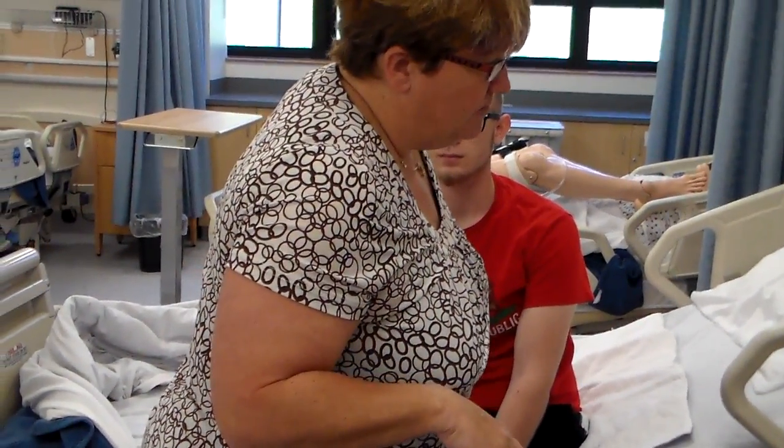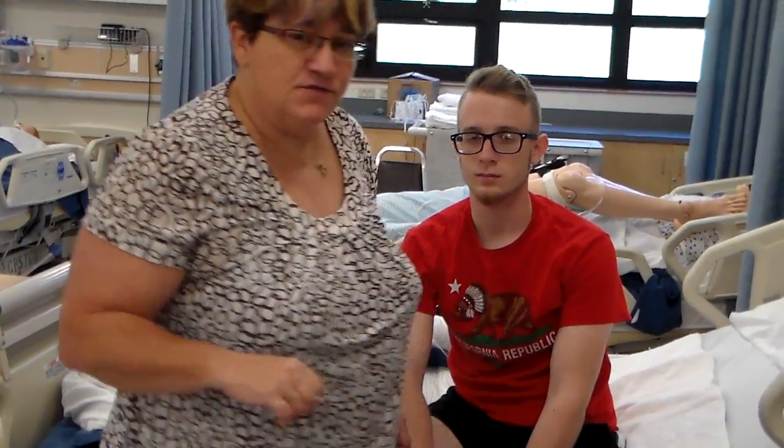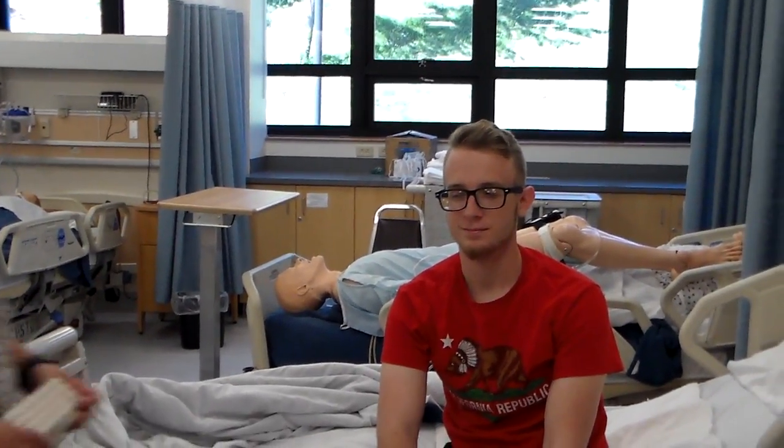And then you're going to place a gait or transfer belt snugly around your client's waist. Oh, I forgot to bring that with me, and I forgot that as a piece of equipment. So I'll get it. Okay, so while I did that, I'm going to keep my eye on my patient because he's sitting on the side of the bed, right?